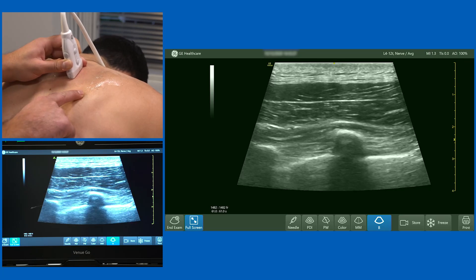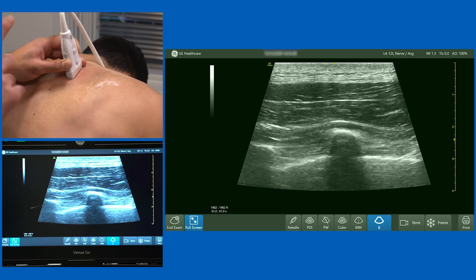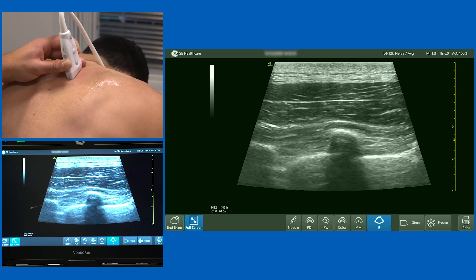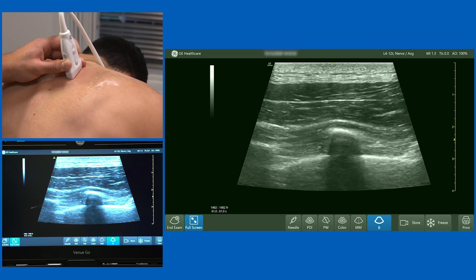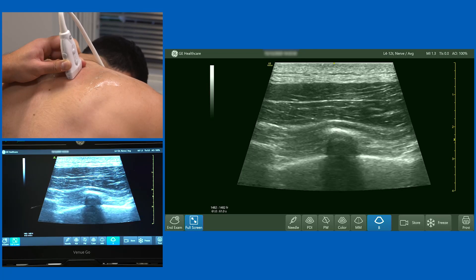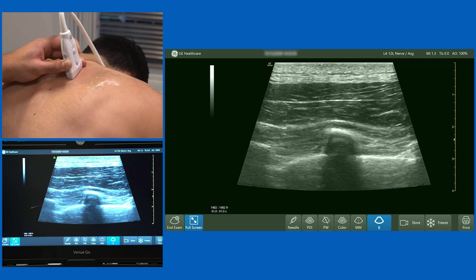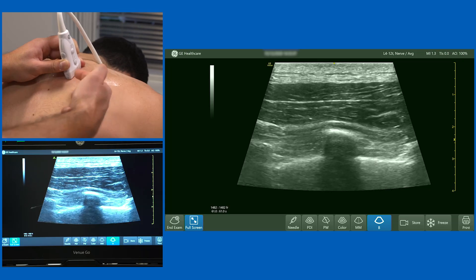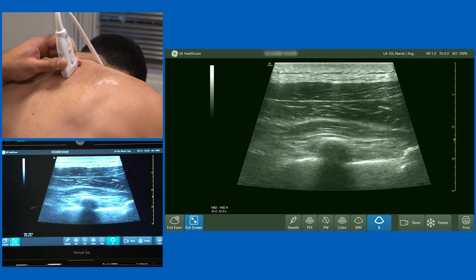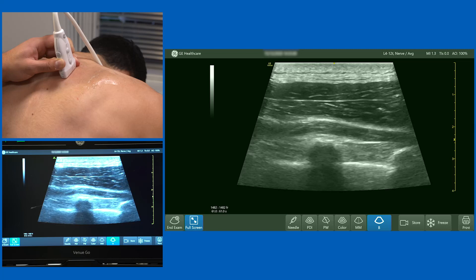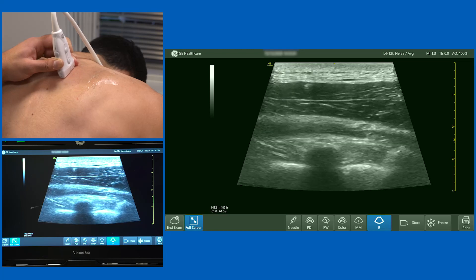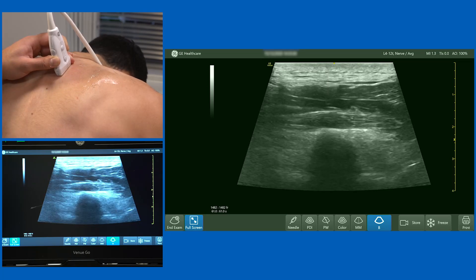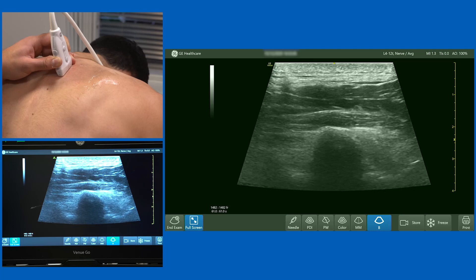So now we're scanning over a rib. This is really important when performing an erector spinae plane block — to orientate yourself, you need to be at the point where a rib meets the transverse process. As we slide medially again, the ribs dive down, there's a thick muscle becoming evident, and now we've met the transverse process.